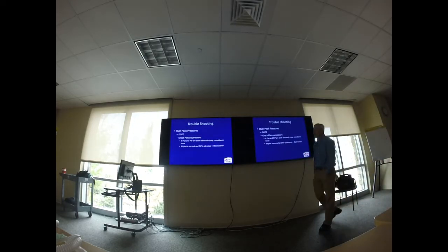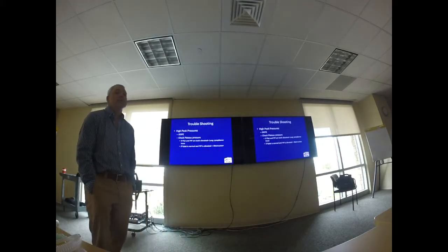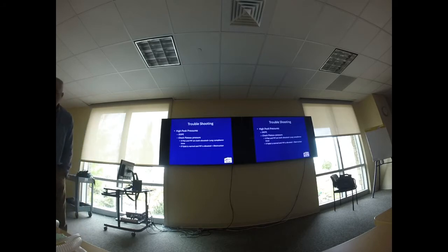You guys, any questions about settings? Is all good? So I think for the most part it's really pretty simple. I think the thing that gets most people is that non-invasive modes of ventilation tend to be quite anxiety producing for a number of people. If you have somebody with a head injury, or status post cardiac arrest or something like that, most of the settings are fairly vanilla.